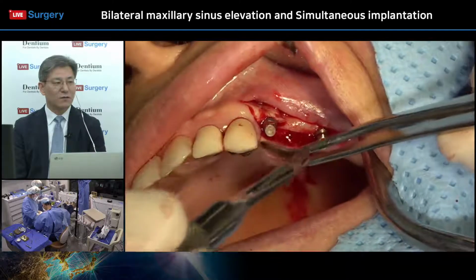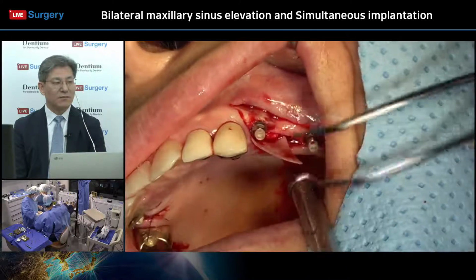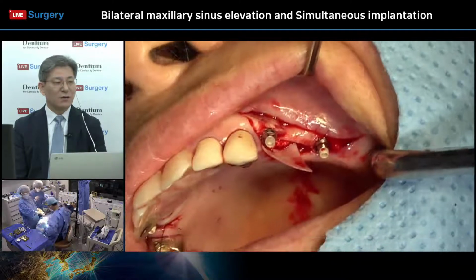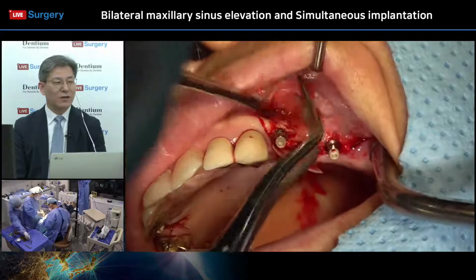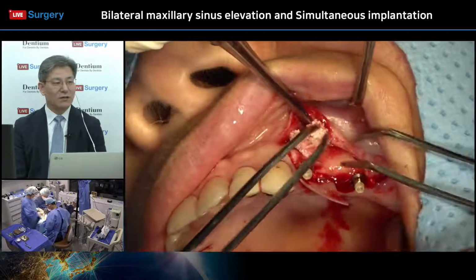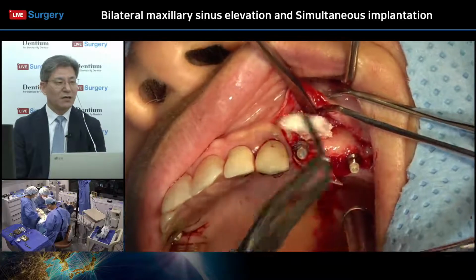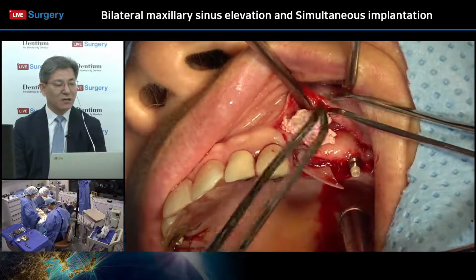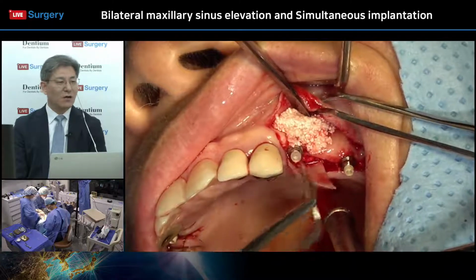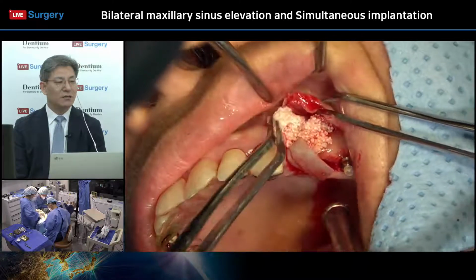Okay. Yeah. He makes some small. Oh, he wants to have engagement of a fixture. Yeah, he wants to have engagement of the collagen membrane to the implant fixture. Okay, so buccal augmentation using Osteon 3 collagen here.